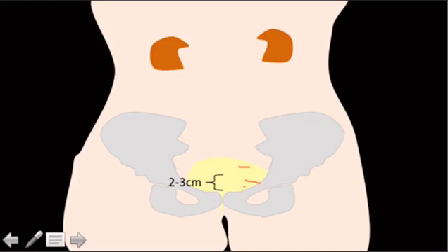Anterior bladder wall, it's an anterior approach. Avoid the trigone of the bladder because that causes bladder spasming over and over and over again when you put a tube in there.